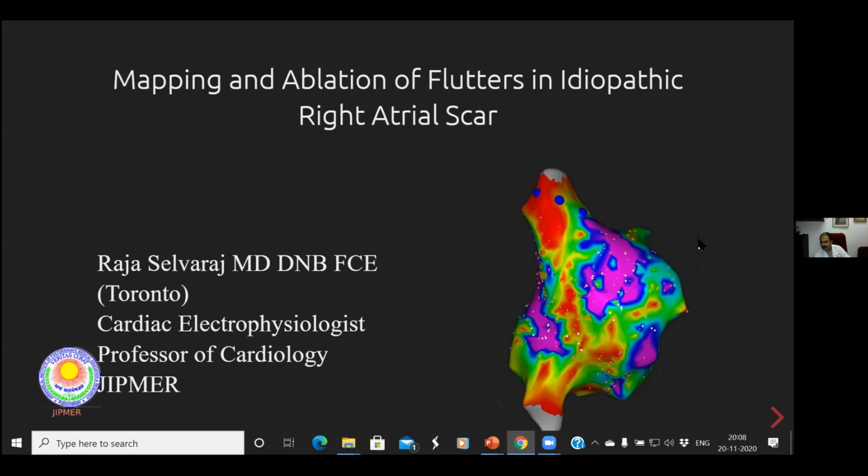So here you don't do anything? You just get in there and map there, or you map elsewhere? Yes, sir. We always position the CS catheter deep inside, as we mentioned at the first point. If we can't get in deep inside, we'll always attempt with the smaller French catheters. Sorry, sir, you can perforate the heart.